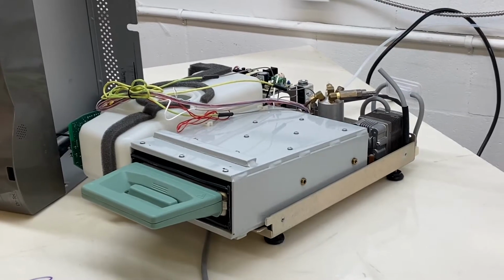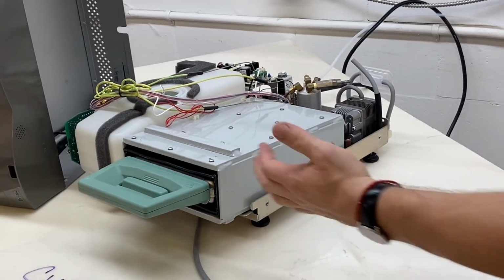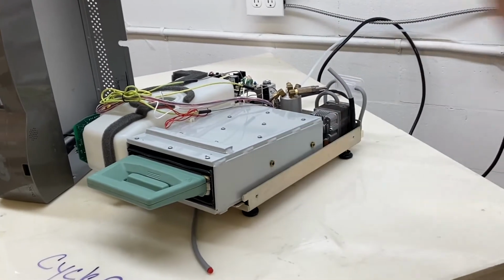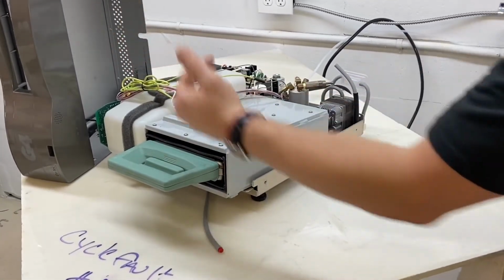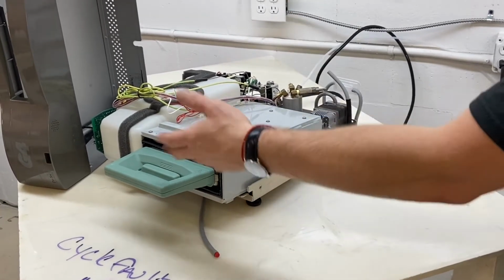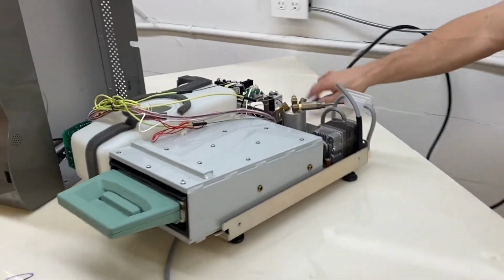So first, we are going to check for visible steam leaks from the cassette. You're going to see on this particular one, if it's in sterilize, you're going to be seeing little wisps out. You're going to be maybe a little puddle. You're going to see very little leaks there. And we're also going to check for kinked or pinched exhaust tubing.